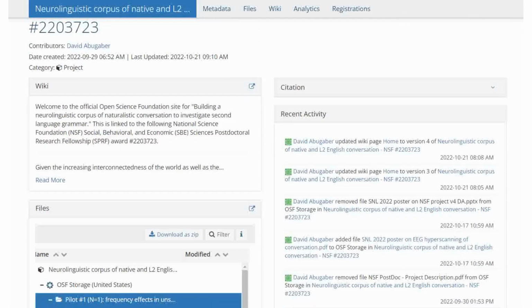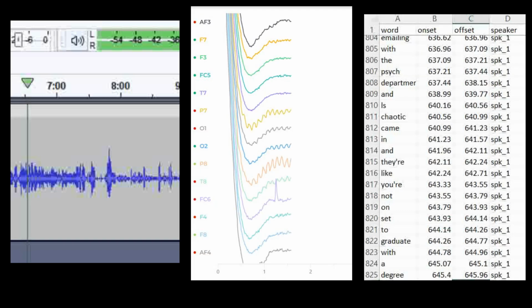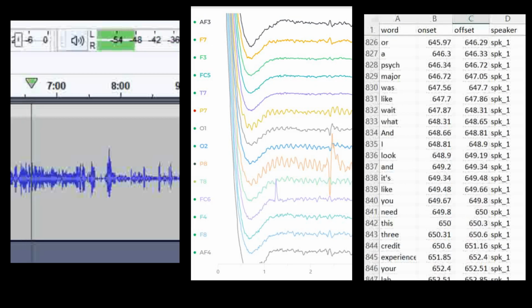It also broadens participation in neuroscience by using a crowdsourceable experiment design with affordable, portable brain scanning devices. Finally, by building an open-access corpus of naturalistic unscripted conversation, the audio, neural signals, and transcriptions will be made available to future researchers to address other language-related research questions.